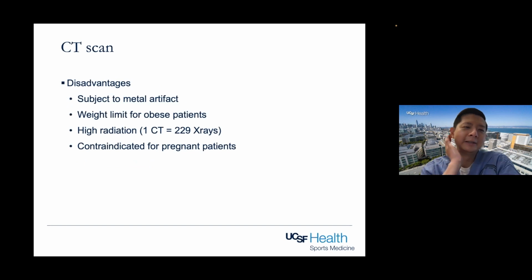Okay, the disadvantages of the CT scan is that when you have metal, it can just basically ruin your image, where there's a lot of artifact from the metal reflecting the X-ray particles. So there's quite a bit of artifact from that. Whereas with MRIs, there's certain sequences where you can try to minimize the metal artifact a little bit better than the CT scan. CT scan is like a smaller tube, so if you have a large patient, they won't be able to get it.